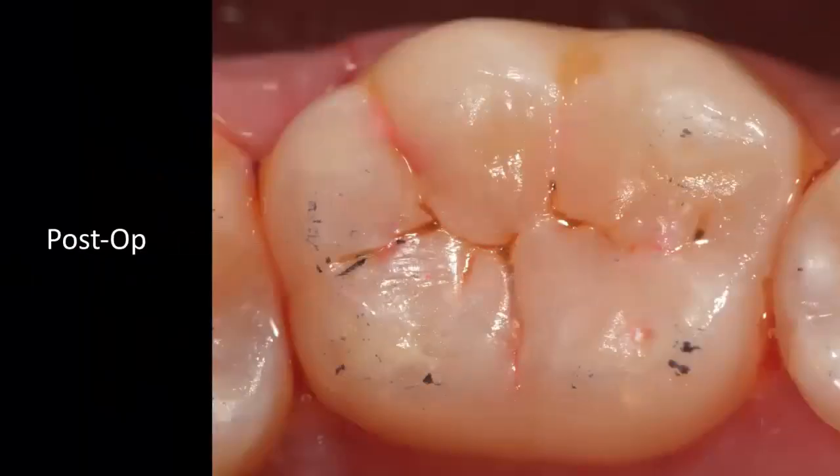After the removal of the rubber dam, see the occlusal spots. These occlusal spots are mandatory to check for the occlusion. Remember, the functional cusps of the lowers are the buccals, and for the uppers they are the palatals. The functional cusps will retain the vertical dimension of the face.